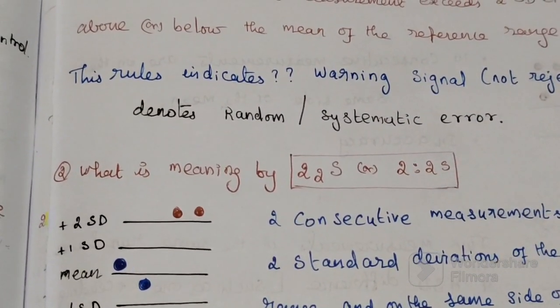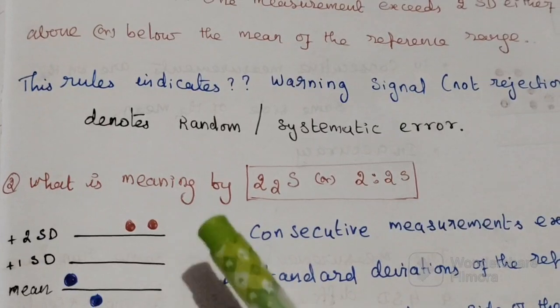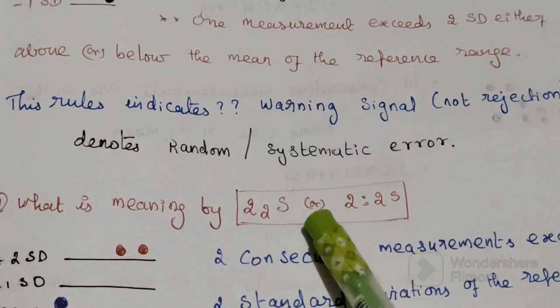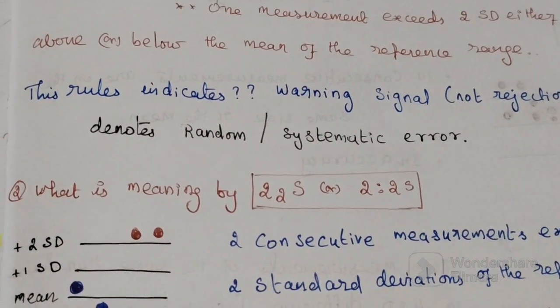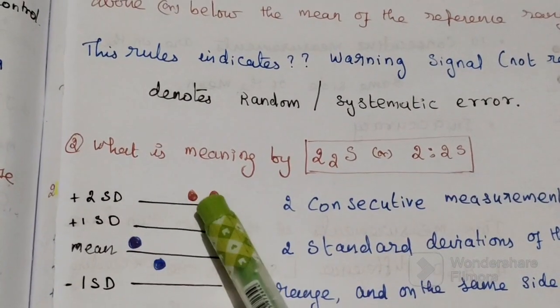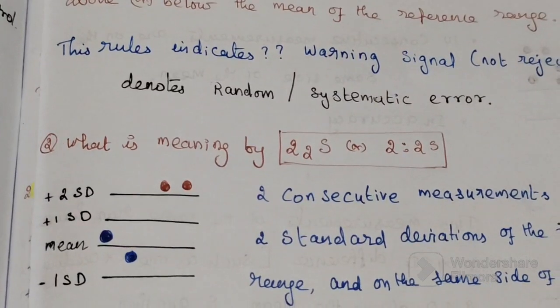Now the second rule is 2 2s. This is how we write it. The first 2 is the number of control measurements, and the second 2 is the standard deviation. So here you can see 2 consecutive control measurements above 2 standard deviation limits. So this is the 2 2s rule. This rule is across run. Why is it called across run?